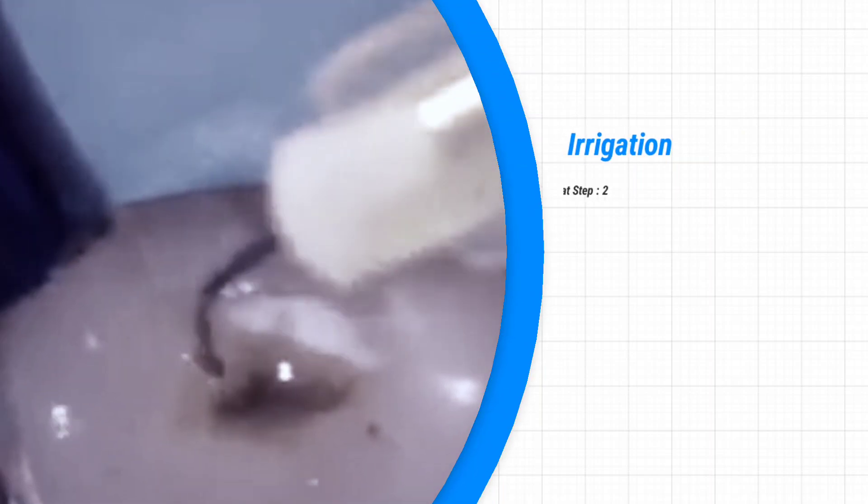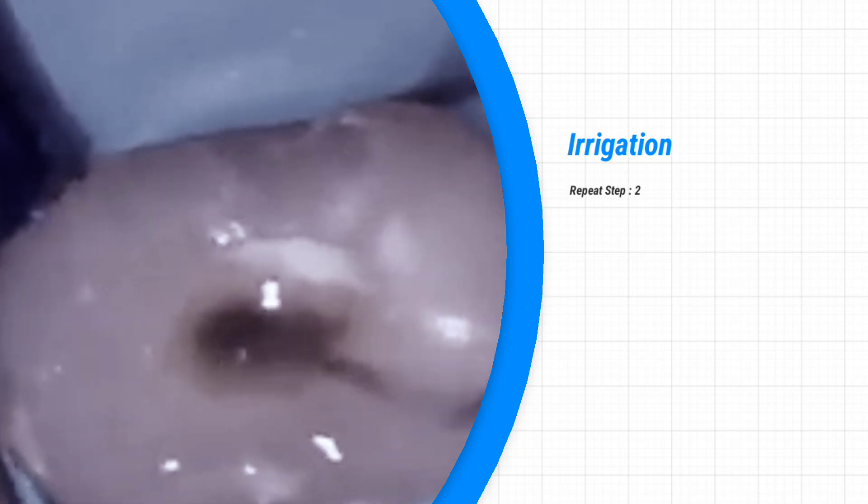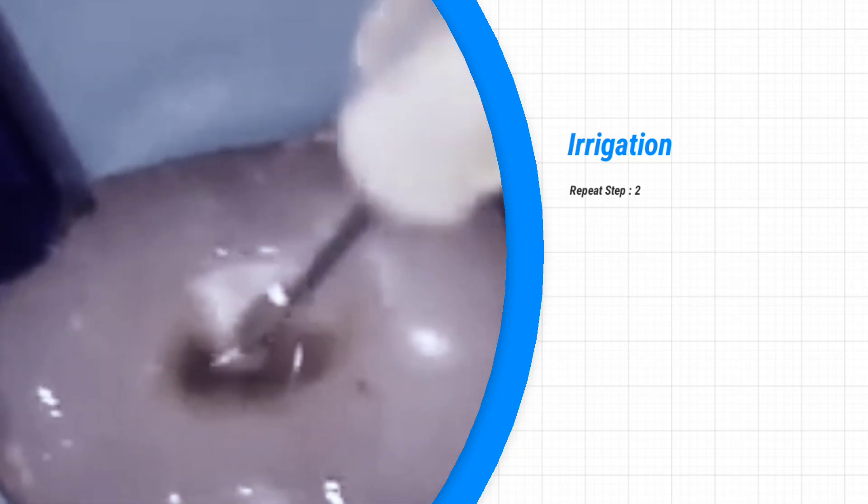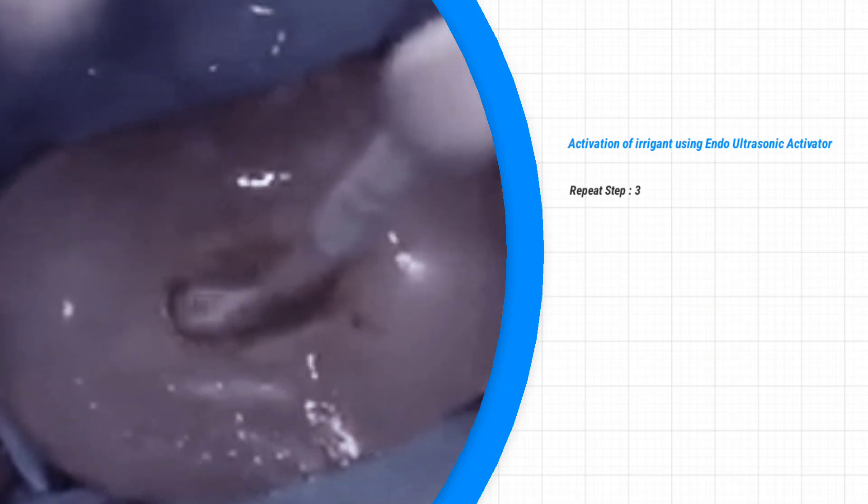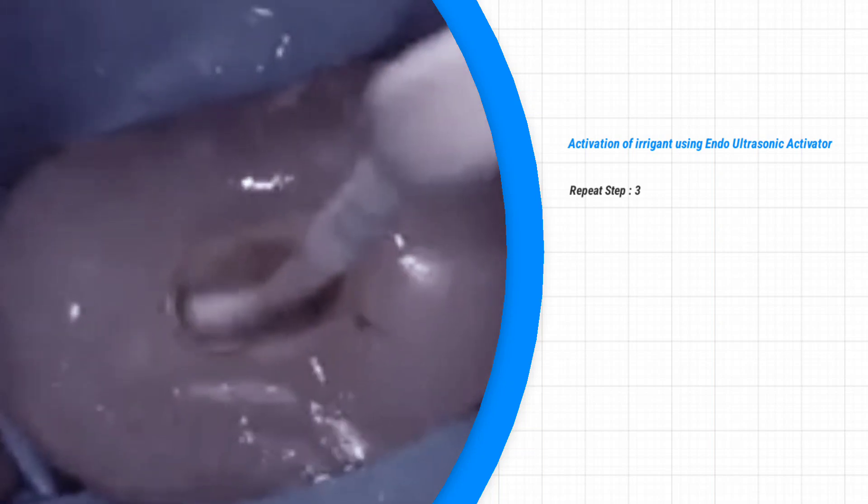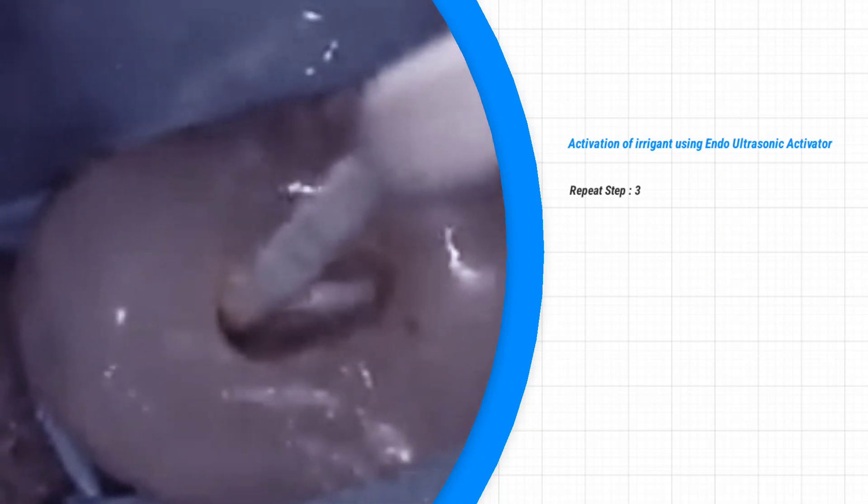Next is the irrigation. Use a side vented needle to inject sodium hypochloride solution into the canal. Then repeat the activation of the irrigant using endodontic ultrasonic activator. Agitate the solution using short vertical strokes for around 30 seconds.